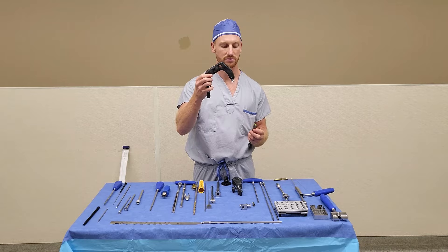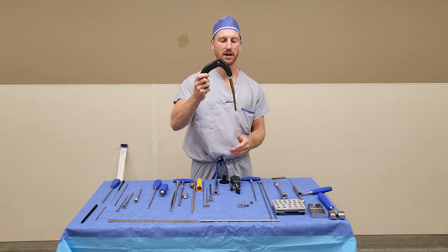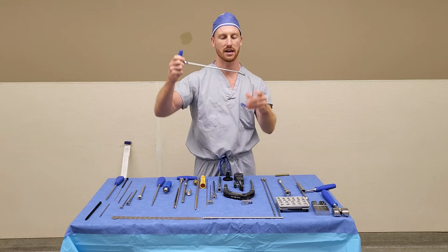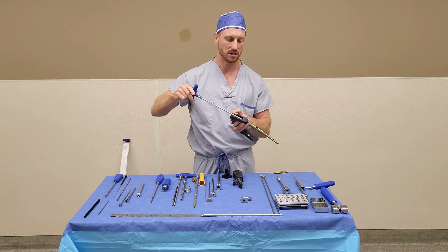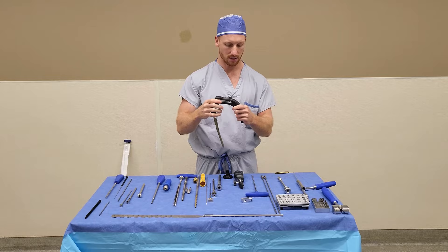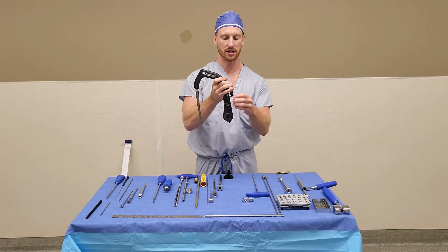The nail is self-retaining on the handle — it can only fit in one direction, so press it on like so. Then you need to grab your connecting screw and your connecting screwdriver. That sits on the top; again, it is self-retaining. Insert that on top of the nail and twist until it is tight.